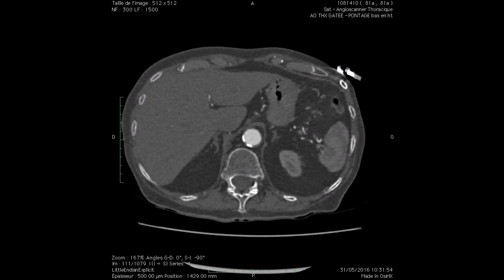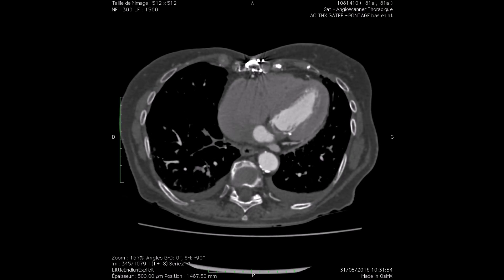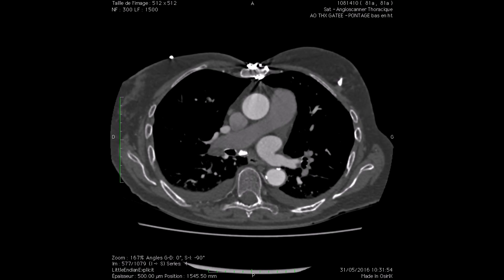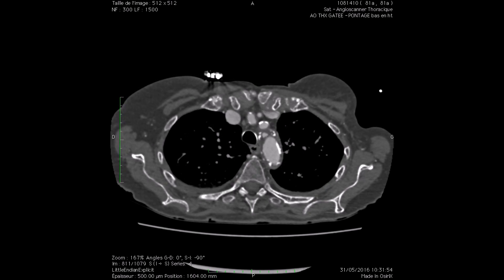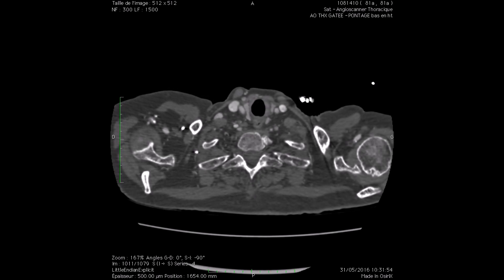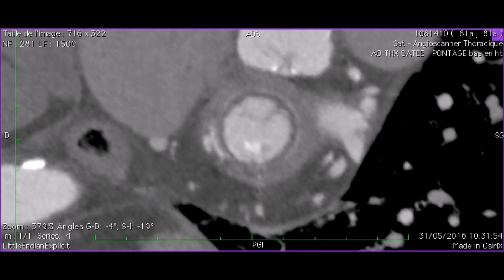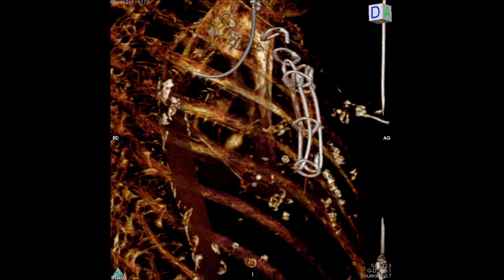Preoperative workup included a CT scan which showed an enlarged left atrium without other anomalies. The scan also helped us in studying the left ventricular outflow tract, the valve, and the geometry of the left ventricle with the surgical anatomy of the apex. The scan also gave us the working fluoroscopic view, which was a caudal and right anterior oblique.